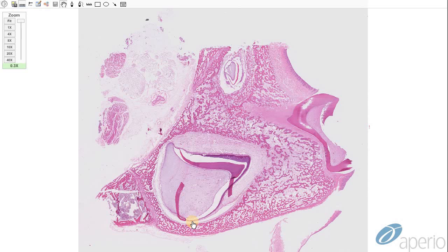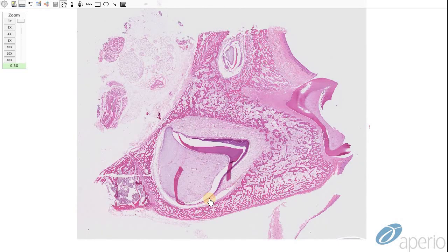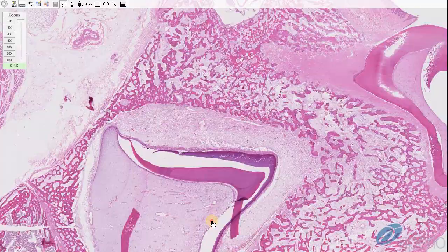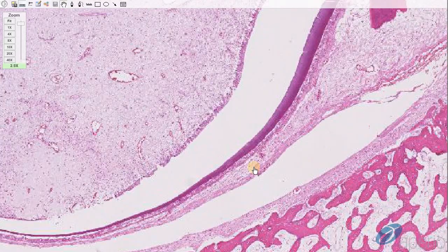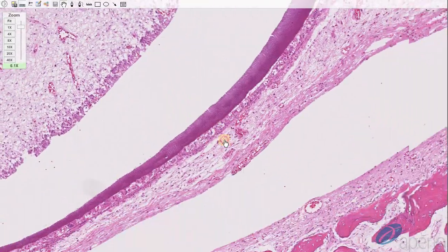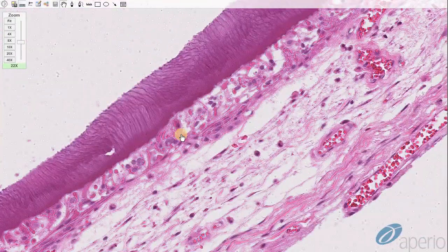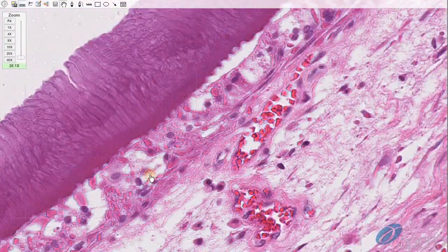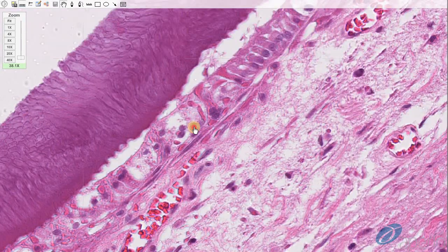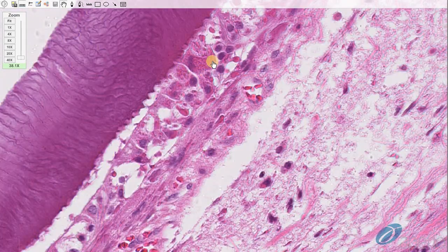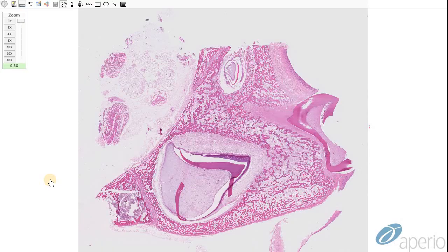Finally, this is a case of enamel hypoplasia secondary to canine distemper viral infection in a dog. At higher magnification, we can see degeneration of ameloblasts with numerous intracytoplasmic inclusions and syncytial cell formation.